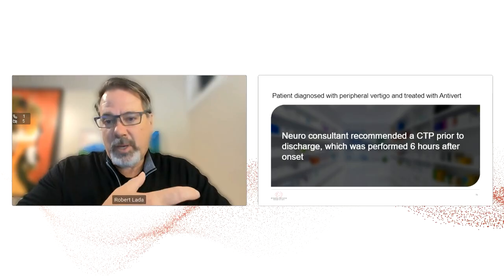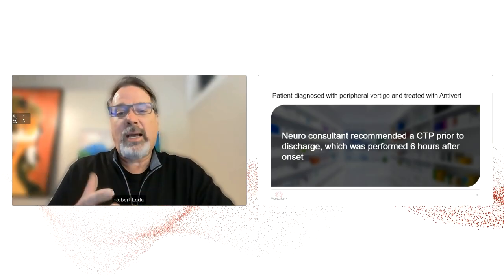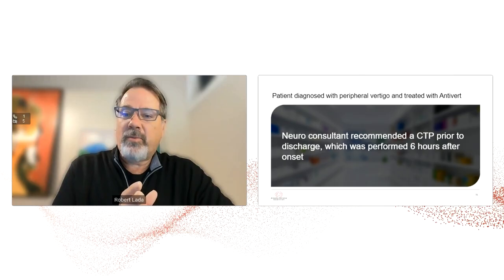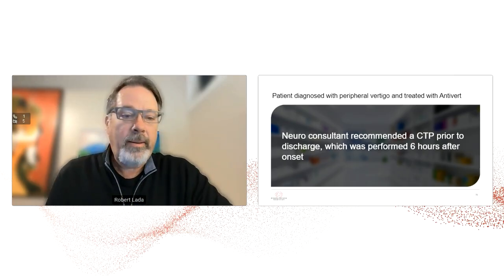By functional, I mean not in the sense of a psychiatric functional diagnosis, but more functional in terms of looking at the pathology in real time. And that can really help make decisions.